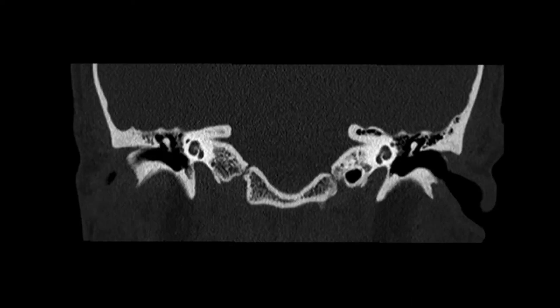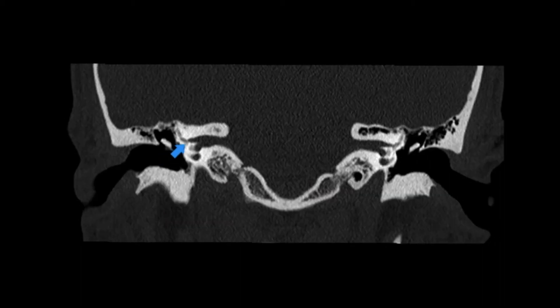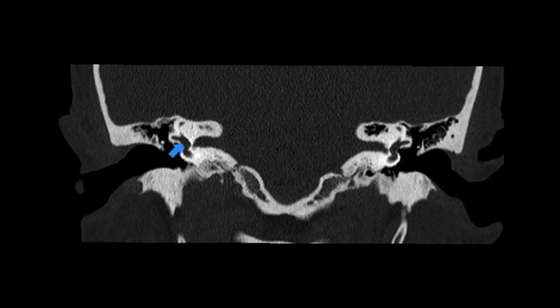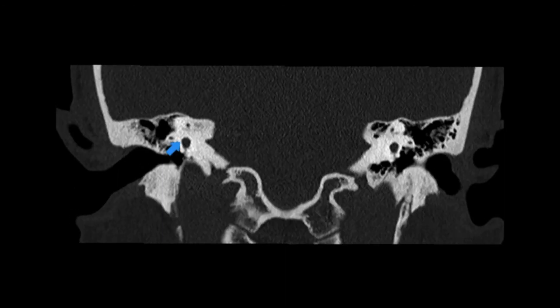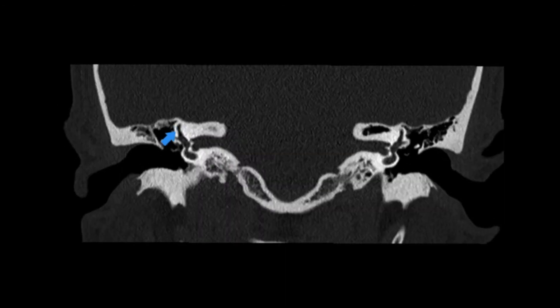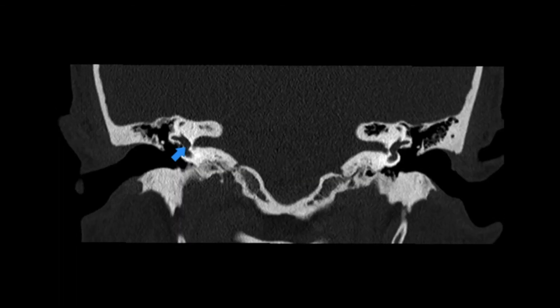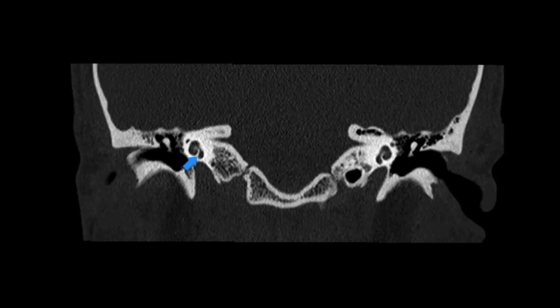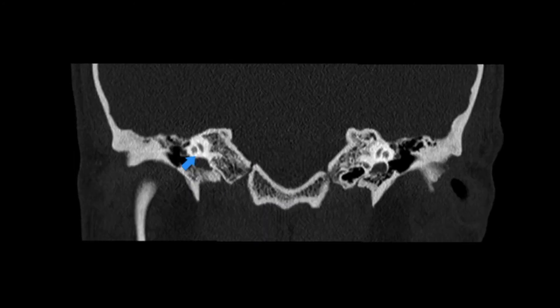To look at the anatomy in a bit more detail, let's have a look at a coronal bone-enhanced slice to highlight the semicircular canals and cochlea. Here is the vestibule and arising from it you can see several semicircular canals being indicated by the arrow. Another component of the inner ear structure is the cochlea, and it has this typical two and a half turns that gives it this spiral shaped appearance. You can see it being outlined now.